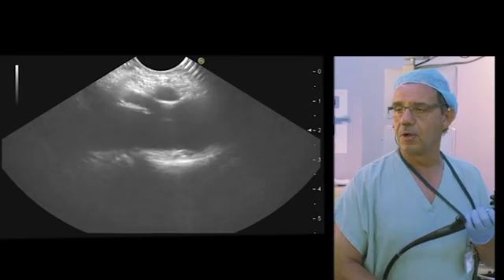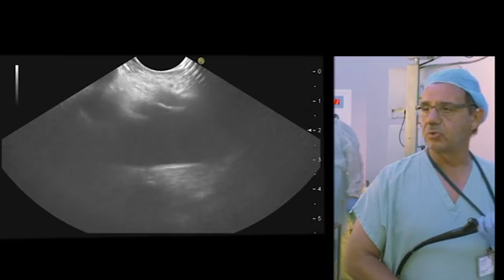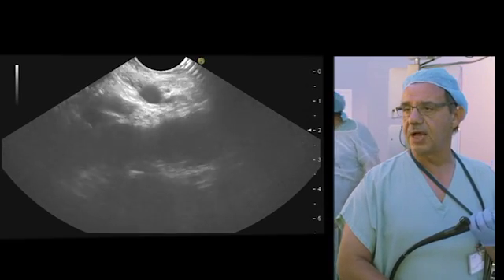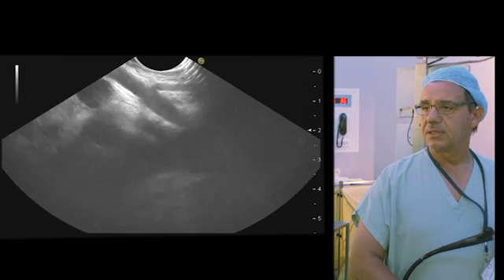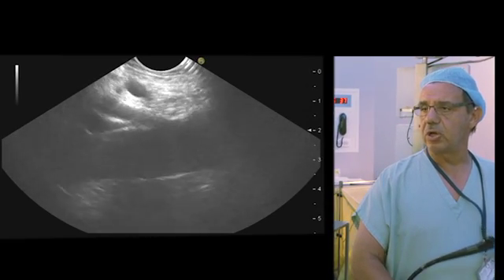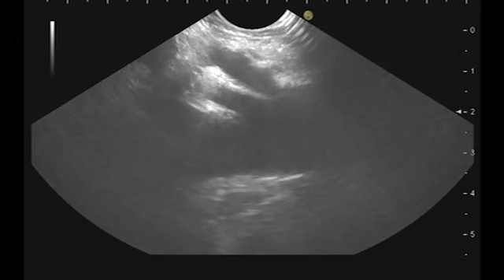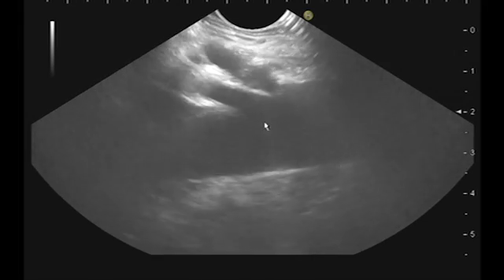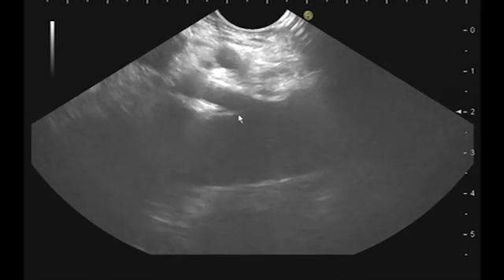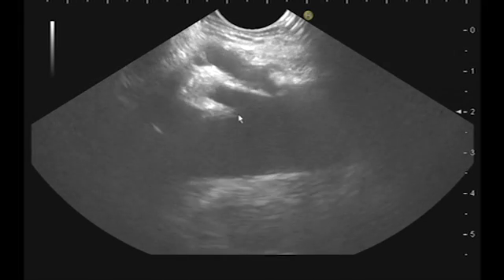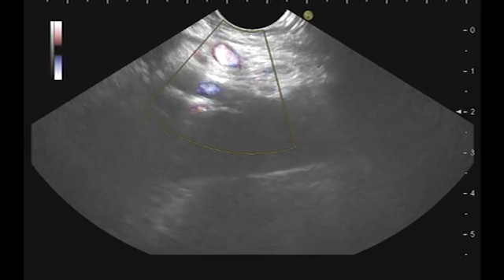Now, if I do a clockwise rotation, we have here the celiac trunk. The celiac trunk, the superior mesenteric artery at the level of the aorta.